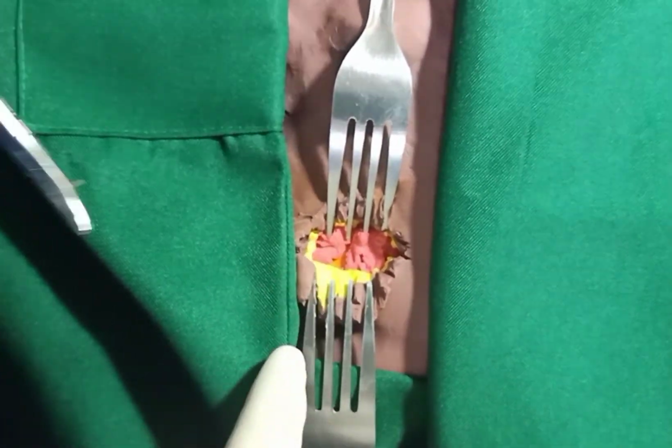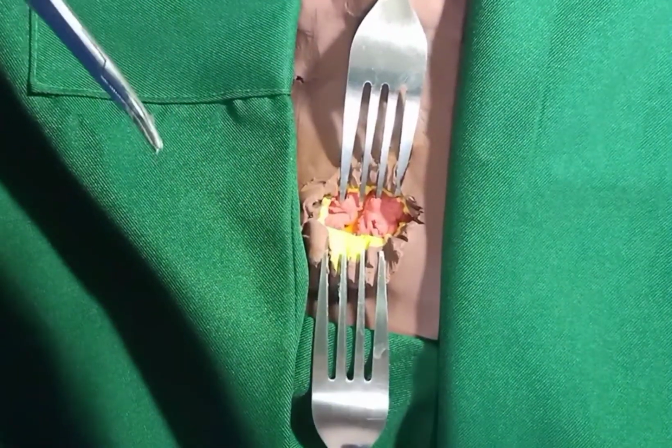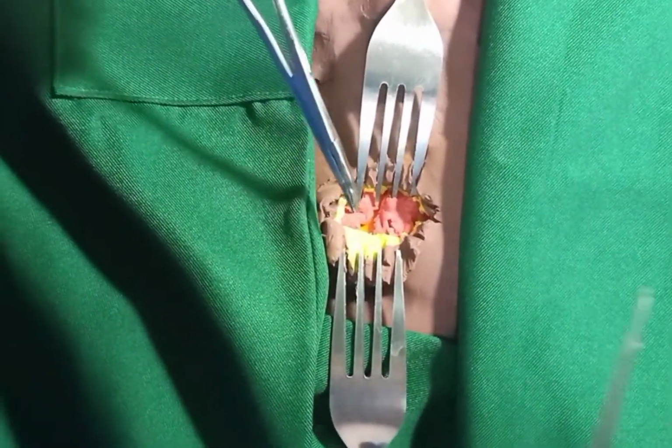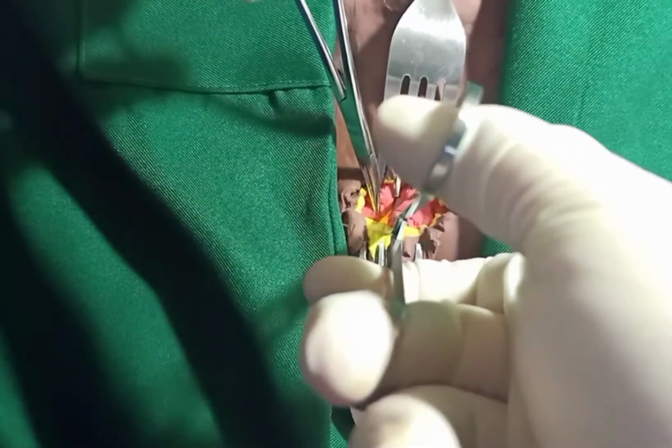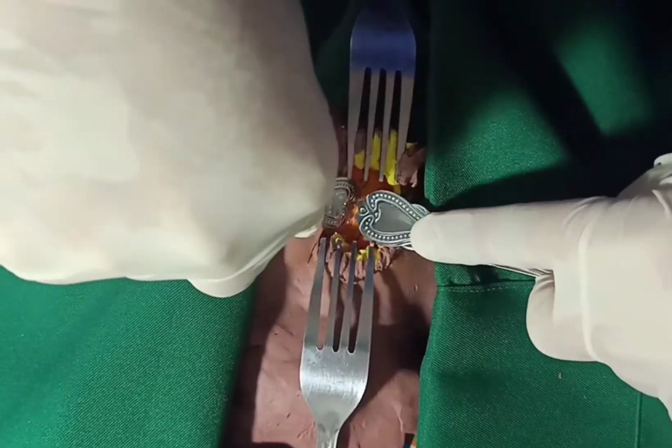Then identify the midline cervical fascial plane between the sternohyoid muscles and divide this intermuscular plane by spreading with a pair of scissors. Repeat this maneuver to separate the sternothyroid muscles and retract the muscles laterally.